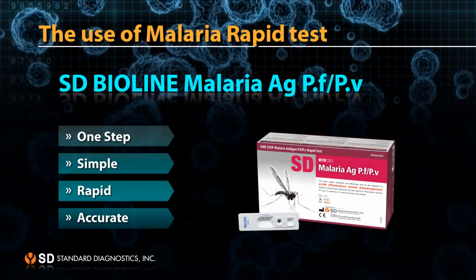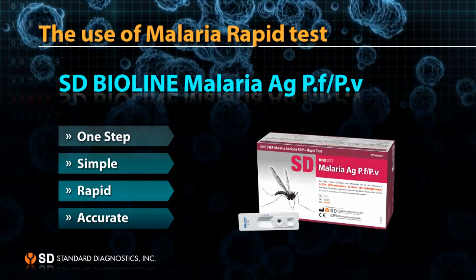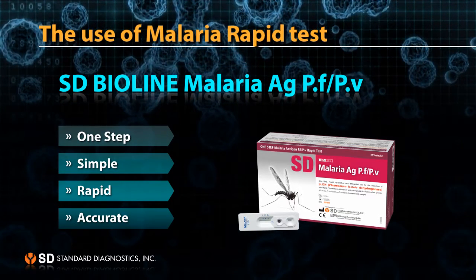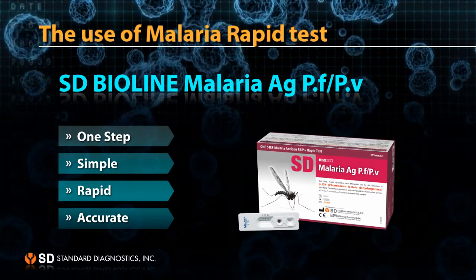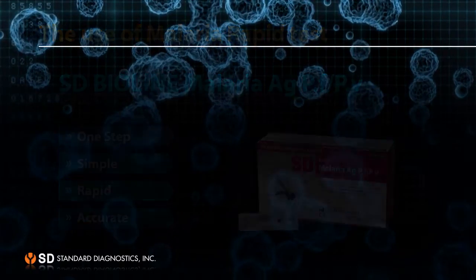Malaria Rapid Diagnostic Tests (RDTs) assist in the diagnosis of malaria by detecting evidence of malaria parasites in human blood. The SD Malaria Antigen PF/PV rapid test is a one-step, simple, rapid, accurate test.